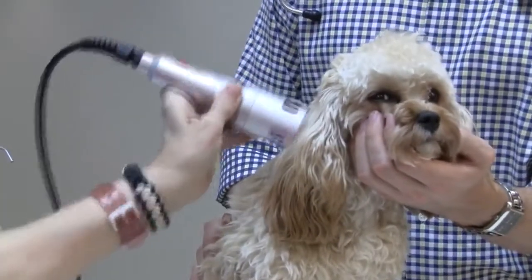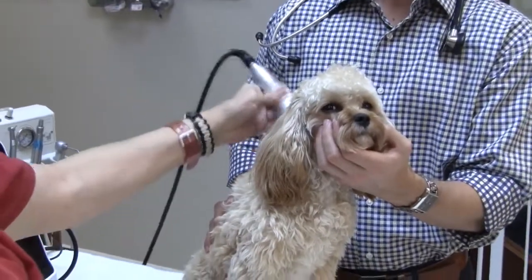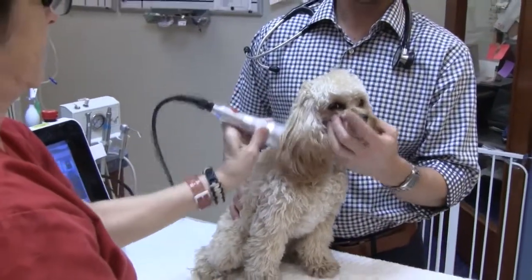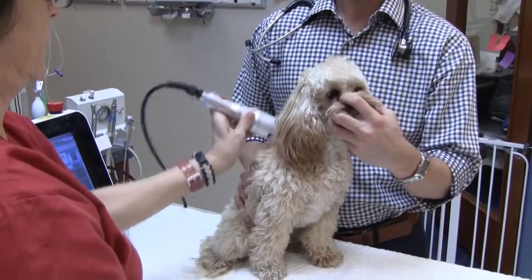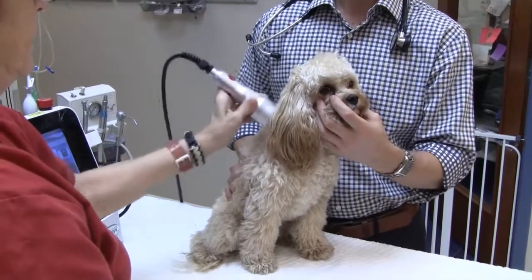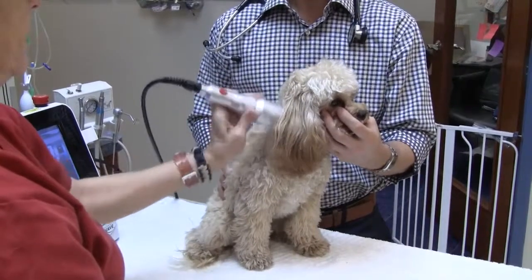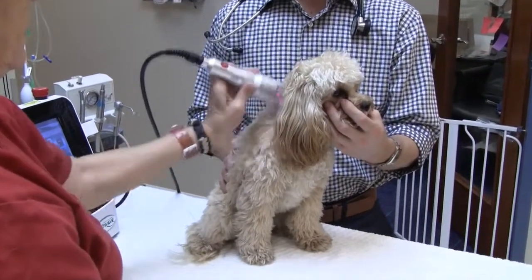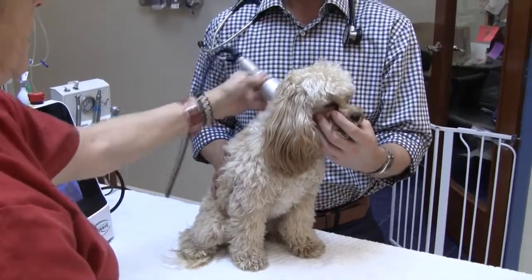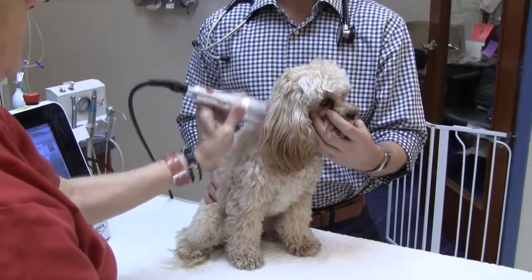As you notice, Ginger does not need to wear glasses because it is not a treatment that is near her face. We do have one of our feline patients who has his nose lasered on a bi-weekly basis, and we have these little leopard glasses for him to protect his eyes from any potential damage from the laser. As you can see, it is not painful like an injection. It usually has a warming sensation, so it is very easy to do this form of pain management.